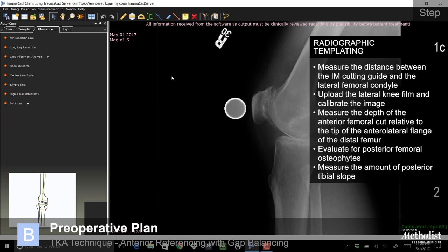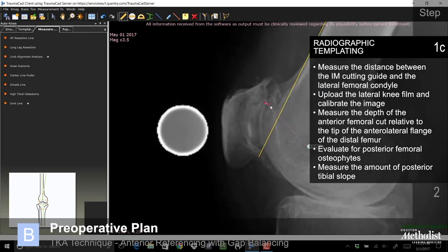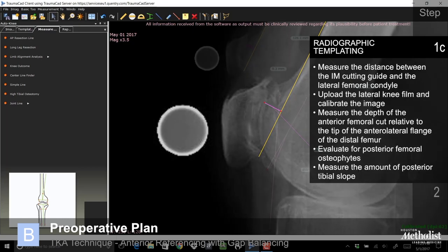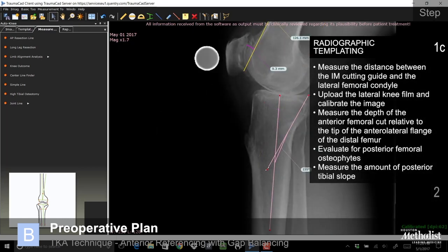Upload the lateral knee film and calibrate the image. Measure the depth of the anterior femoral cut relative to the tip of the anterolateral flange of the distal femur. In this example, there is a large amount of anterior trochlear bone which will be removed during the procedure. Evaluate for posterior femoral osteophytes. A measurement of the posterior tibial slope can be performed on the lateral radiograph; however, I routinely do this as an intraoperative measurement.